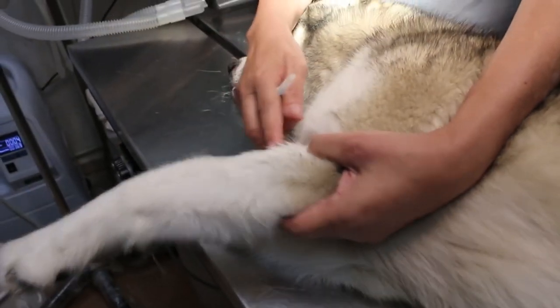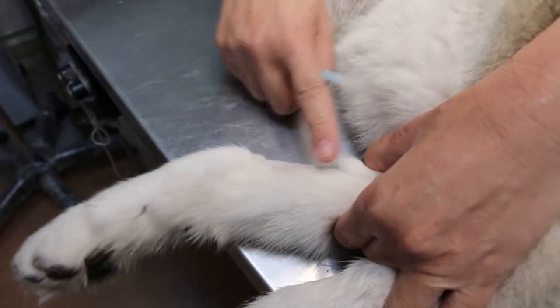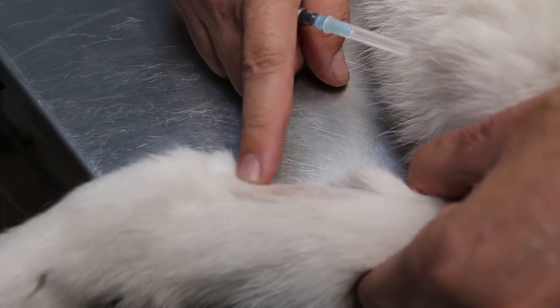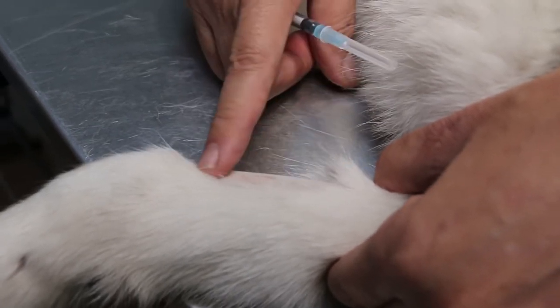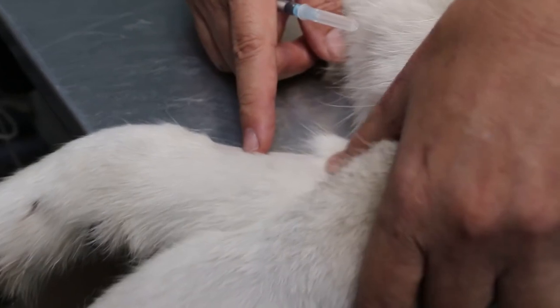Now to sedate the dog — I'm talking to the interns — you don't need to shave the hair. Because this is a big dog, you can actually see the vein or feel the vein. Although university teachers use shaving, it's not ideal because it looks like a blemish.